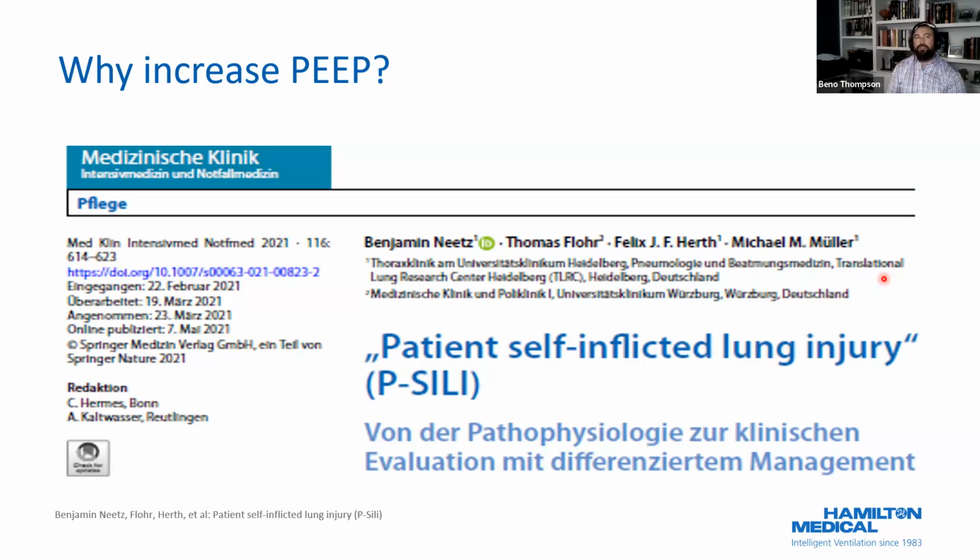But they all say the same thing. So what they have all found is that diaphragmatic contractility, the strength where the diaphragm contracts, is directly linked, almost a reflexive or instinctive thing, to your patient's optimal PEEP and how close you are to that. So the farther away from the patient's optimal PEEP you are, the harder that diaphragm is going to instinctively and reflexively contract. So your work of breathing is going to go up if your patient is under PEEPed, right? The more under PEEP they are, the more they're going to work.